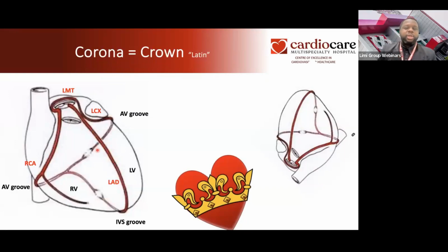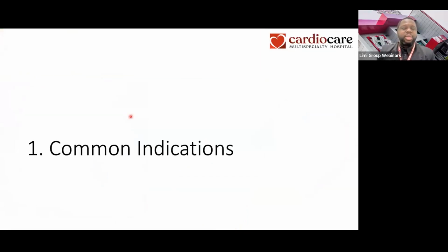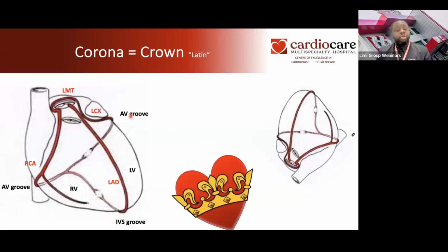But notable is, like we showed you, the main coronary arteries come out as the left main and the right. And occasionally, about 3 weeks ago, I did a case where there were three different origins: the right coronary, and there was no left main. The left circumflex and the left anterior descending both came out from the aortic cusp. So occasionally there are natural or normal anatomic variants that happen from time to time.